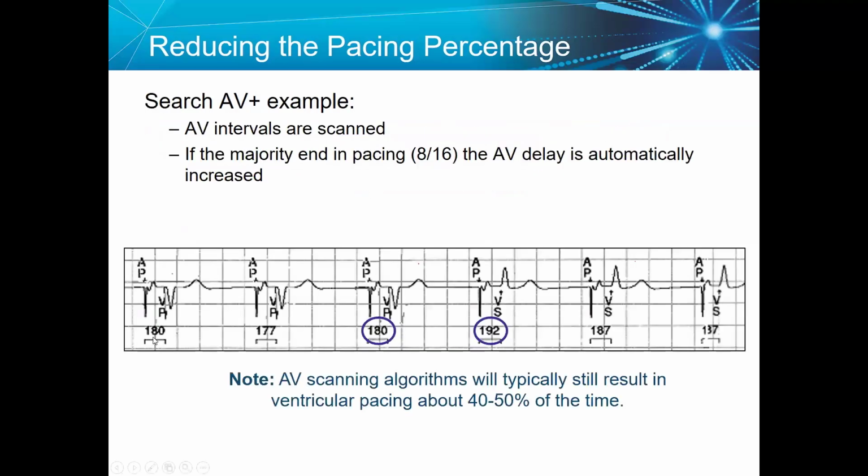Here, it is a good example that we see in the surface ECG: atrial pacing, ventricular pacing, atrial pacing, ventricular pacing, atrial pacing, ventricular pacing, and then increase the AV delay. Okay, atrial pacing, ventricular sensing, and continue as atrial pacing, ventricular sensing by increasing the AV delay, and this will guard the patient against RV induced cardiomyopathy.